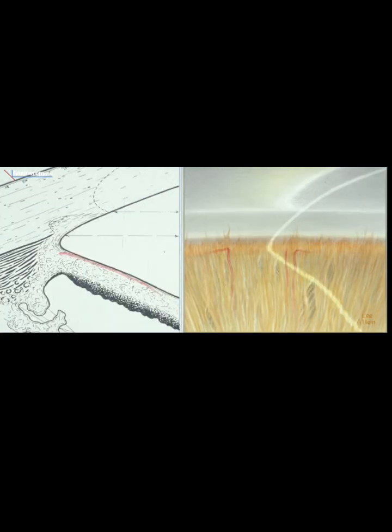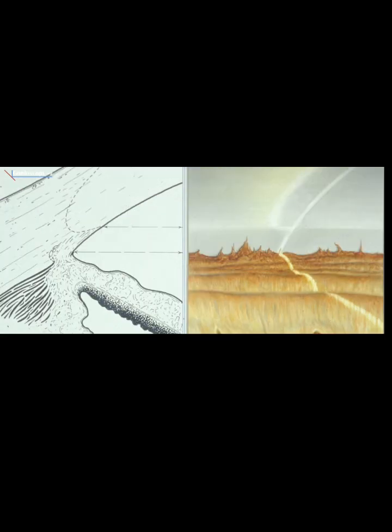This is an angle that inserts right at scleral spur. You can see that the angle width is wide. There's no pigment. Interesting thing about this iris is just how flat and featureless the iris is. This looks like a Fuchs heterochromic iridocyclitis to me. I don't really know what Lee Allen was drawing here. So this is a C, inserts right at scleral spur. We don't really see much of any ciliary body face, 50 degrees, flat, really flat, and no pigmentation. This is inserting into the trabecular meshwork, so it's a B, again wide open, flat, no pigment.